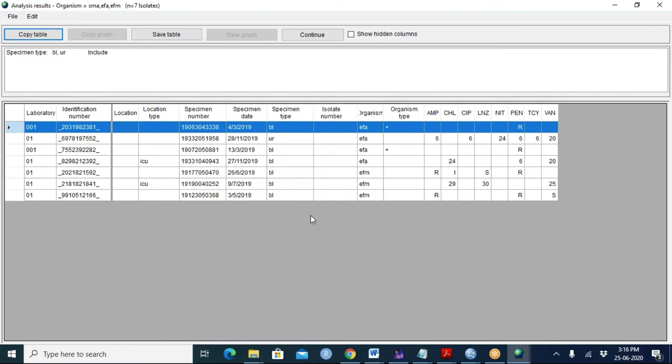So we can do a lot of macros within a single page? You are doing two macros on the same page, right? Well, sort of. What we are doing are two analyses using the same macro. It's the same macro, but that macro has multiple components. So all we did is basically exactly the same analysis, except we changed the organism. If the macro is very similar, that's what I do: Begin Analysis, make changes. Begin Analysis, make changes. So if it's different variations, like different organisms or different specimens, I do it inside of the same macro. On the other hand, if the macros are completely different, I just make a different macro.